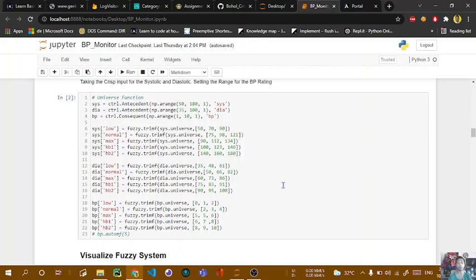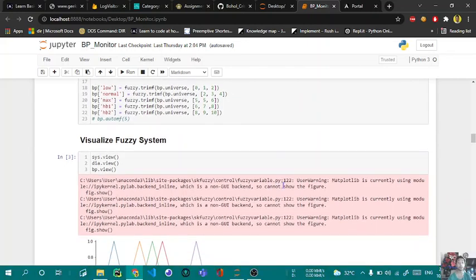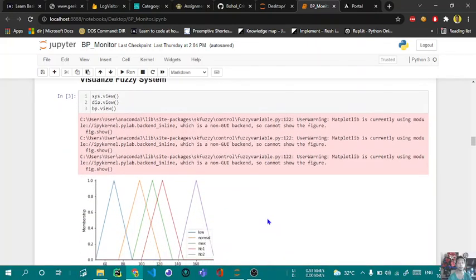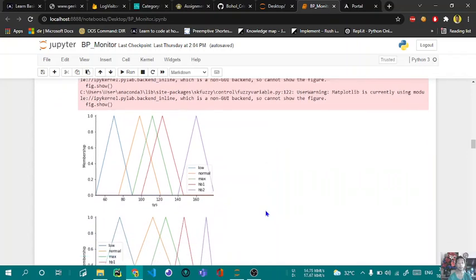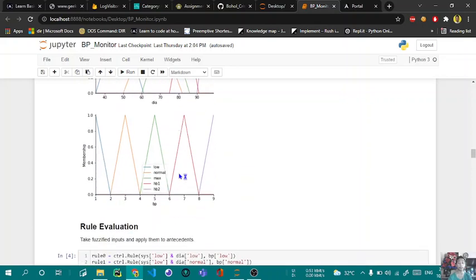So why is there a BP rating? If I have a max result, how much percentage of my BP is it? If I have max, maybe I have 60% max blood pressure. To visualize it, we need to call the view function. So here we have systolic, diastolic, and the BP rating.